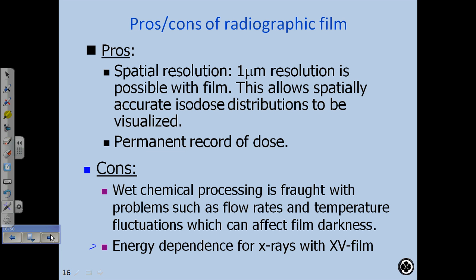Okay? And we would use film when the portal imager was down, or I don't know, for verification during treatment. I don't know. We were using film, but very, very seldom. So what would happen is that the processor would get turned on, and then they wouldn't run too many films. So the rollers would get clogged up because they weren't constantly moving. The temperature fluctuation would change. So for dosimetry purposes, those processors were not good. So those are processor issues.